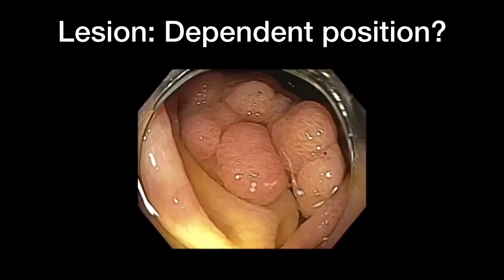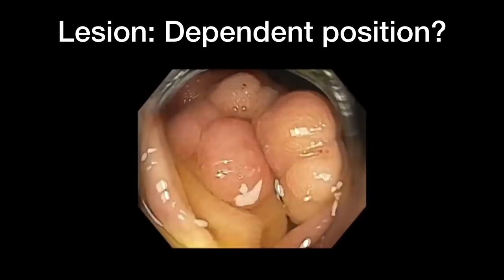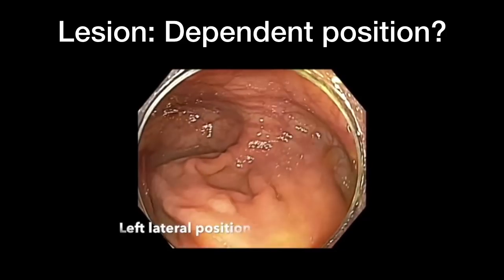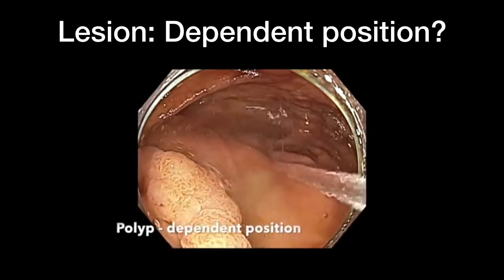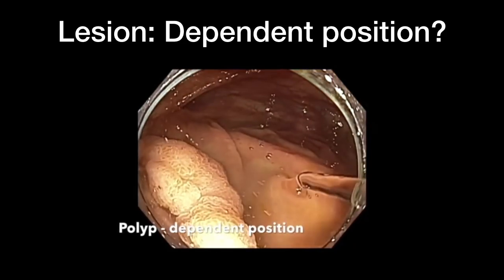Let's focus on bleeding management with special reference to flat lesions. Here is a case — a patient with a large non-polypoidal lesion in the cecum. Once you see this, you want to ask yourself two important questions: Is there cancer? And if not, is the lesion in a dependent position? By flushing water and finding that the lesion is submerged, as you can see in this case, you can easily conclude that the lesion is in a dependent position.